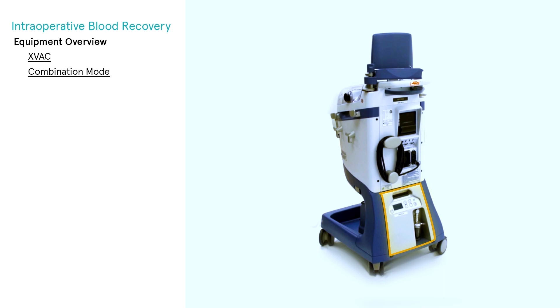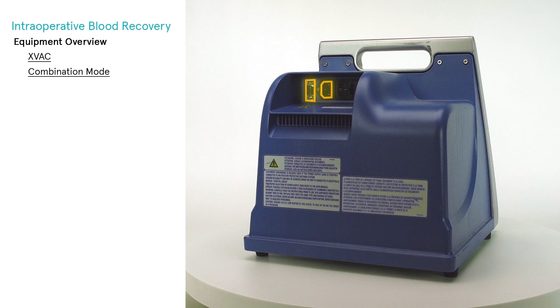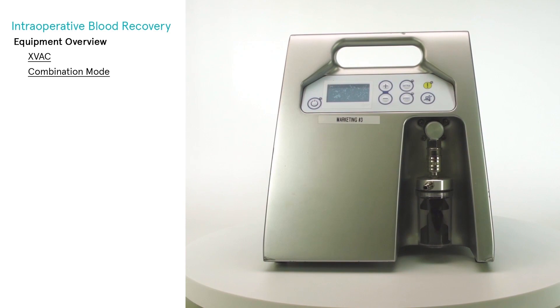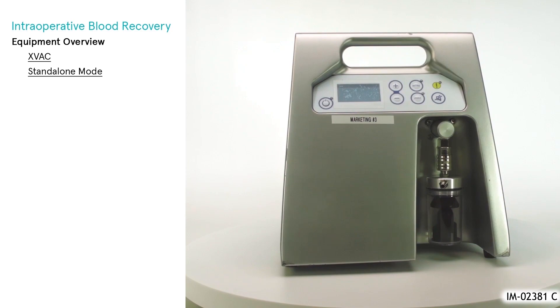The X-VAC vacuum module may be used in combination with Extra when it is installed into the Extra cart and connected to Extra via the power and serial communications cables. The on-off switch, located on the rear panel of the X-VAC module, must always be on to allow the two systems to communicate. The boot time of the vacuum module being shorter than that of Extra, the operator may operate the vacuum module immediately while the rest of the Extra system powers on.